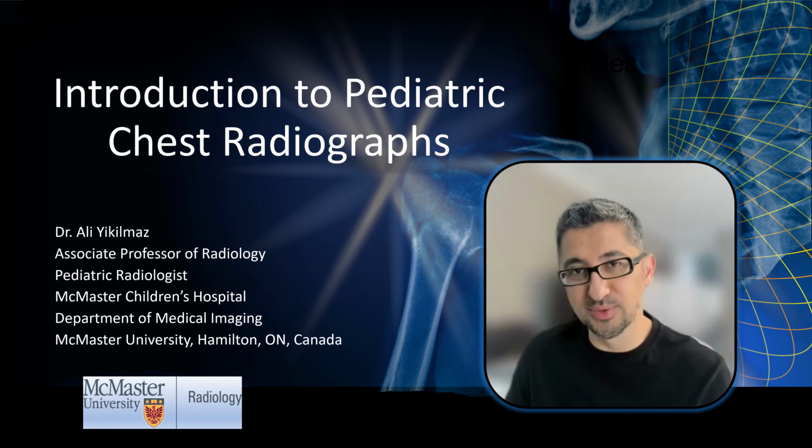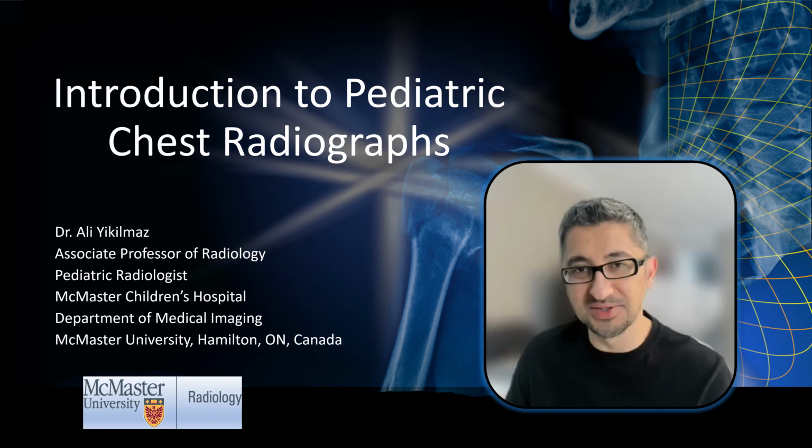I'm a pediatric radiologist at McMaster Children's Hospital, and I'm going to talk about pediatric chest radiographs. This will be a basic introduction lecture for the learners. And here is the outline of my talk. It will include the technique, interpretation, normal variants, paravertebral opacities, pneumonia, pneumothorax, foreign body ingestion and aspiration, and finally trauma.